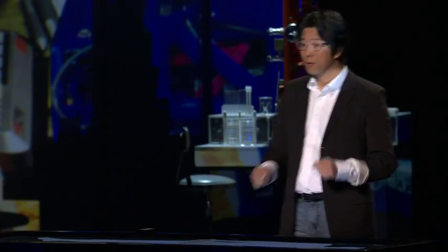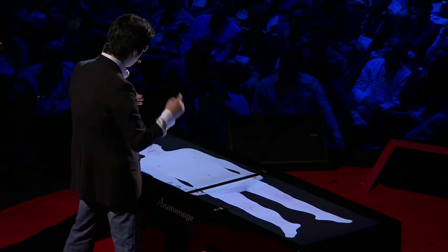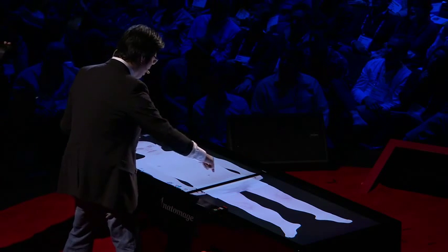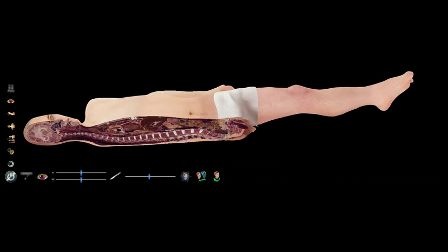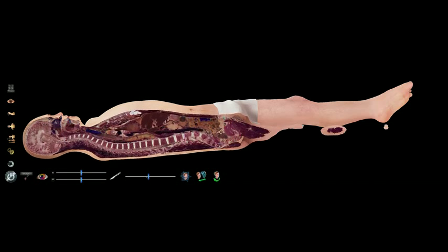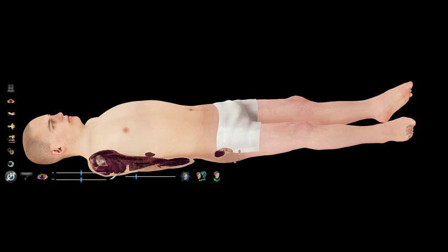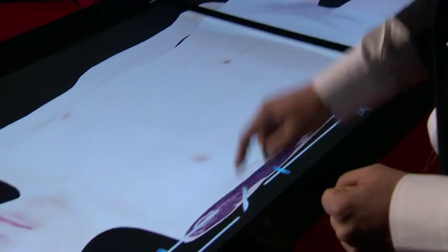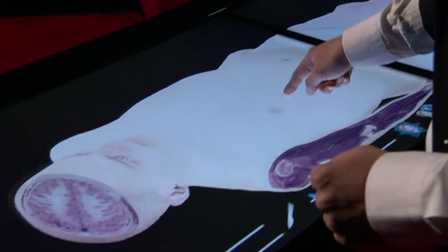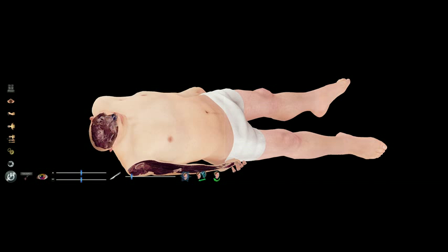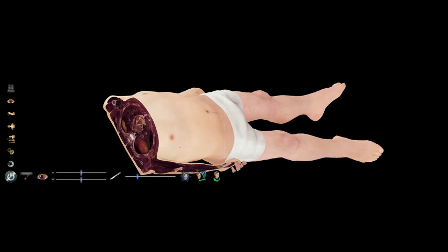I'm going to do some demonstration. As you can see, I use my finger to interact with the digital body. I'm going to do some cuts — I can cut any way I want to. So I cut right here, and it shows inside. I can change my cut to see different parts. Maybe I can cut there to see the brain. I can change my cutting to see some internal organs.